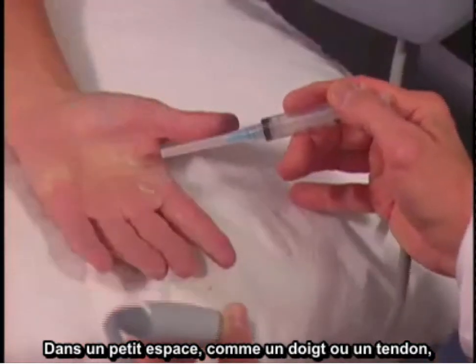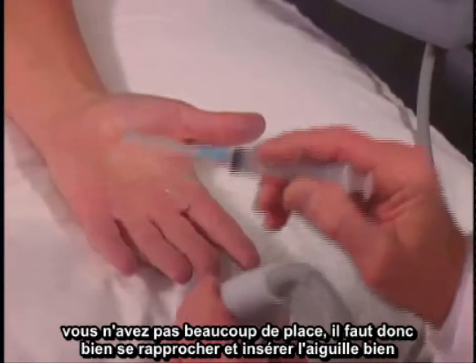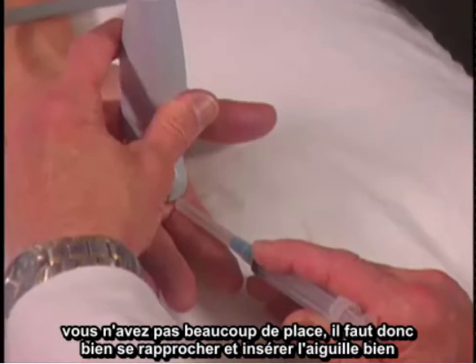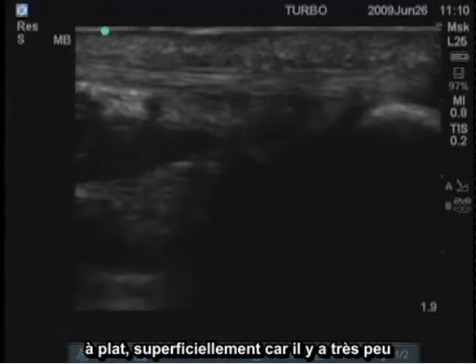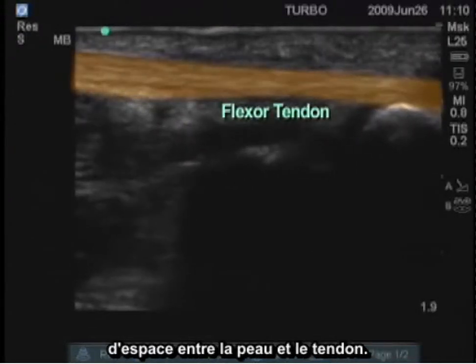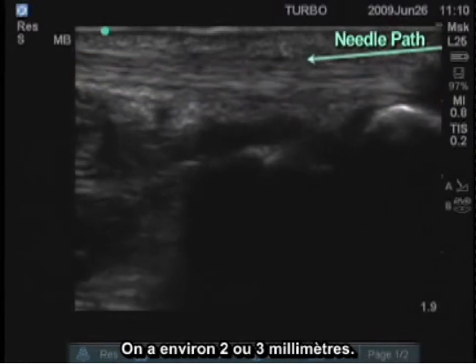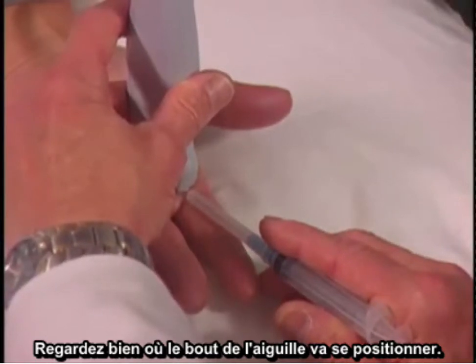In a small area like a finger or a tendon around here, you don't have a lot of space, so you have to go very close, and can insert the needle very flat and superficially because there's very little space between the skin surface and the tendon — here it's probably about two or three millimeters. Watch exactly where the tip of the needle and the bevel goes.